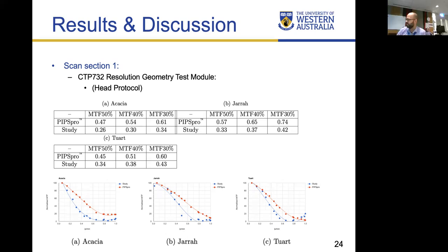Maybe they use a different calculation for measuring MTF, which is unusual. Yeah, or for BIPS, the manufacturer wants to promote good answers. Right, that's the only thing. So we just want to check the quality of BIPS because it's a black box. We don't know what's going on inside. We just want to have some sort of individual or investigational validation for the CBCT system and see if it's close to validation or doing something extremely wrong. Like his method shows that he calculated MTF correctly. Right. It's just the difference; it would be interesting to investigate further. But thank you, Ghazi, for answering my question.